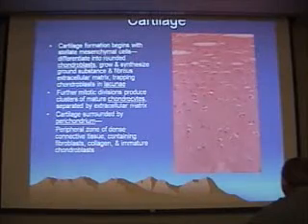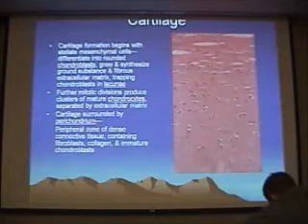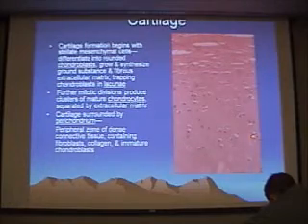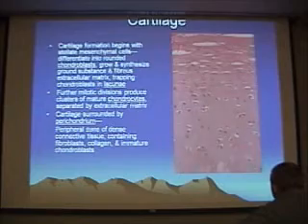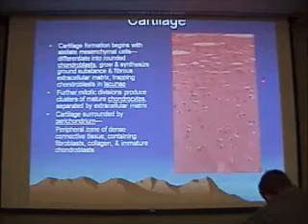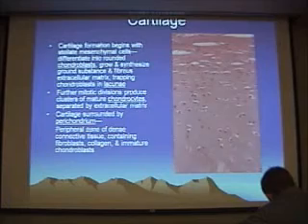And so we see these chondrocytes here scattered throughout. The little spaces they live in are the lacunae. This pink stuff in between represents an extracellular matrix that they produce. As you get to the periphery of a cartilage mass, that cartilage matrix is surrounded by a perichondrium of connective tissue. And you can also often see resting immature cells, or chondroblasts, adjacent to that perichondrium.